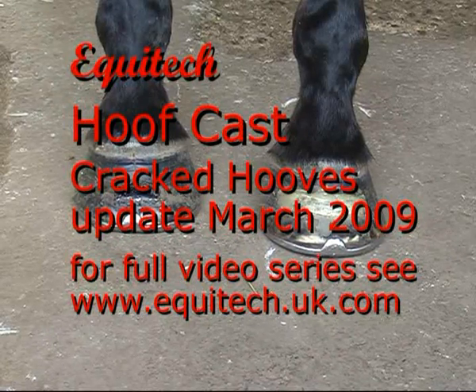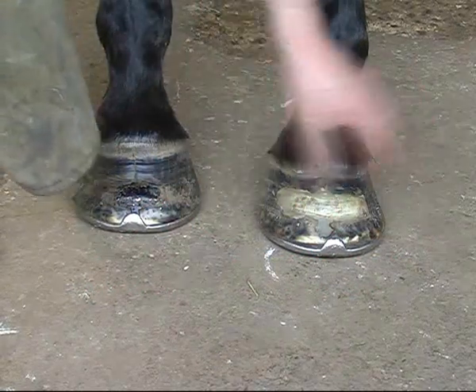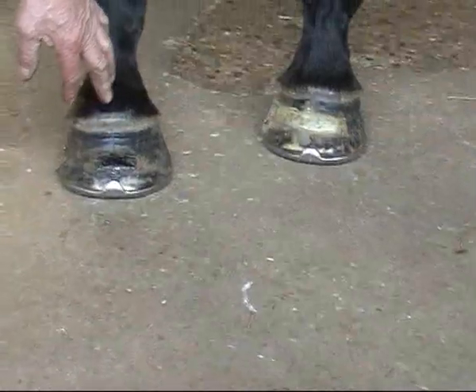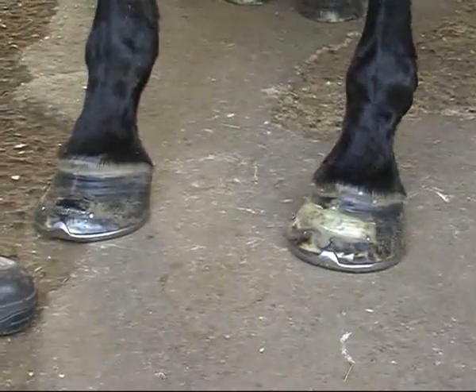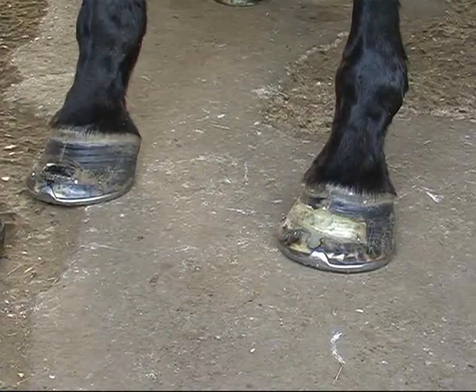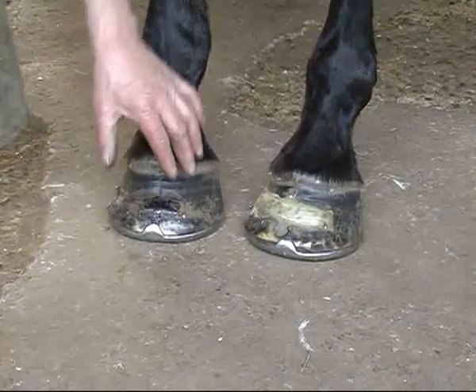This is the horse with the Sirius Copax up his dorsal wall. This is the foot that we've maintained regularly, and this is the one where all I've done is just remove the shoe and remove the bottom of the rebuild with the rasp as they've gone off. This one's been on there now 27 weeks. The foot that we've just allowed the initial rebuild to grow down on, or the crack reinforcement to grow down on, still has a tendency to flare.